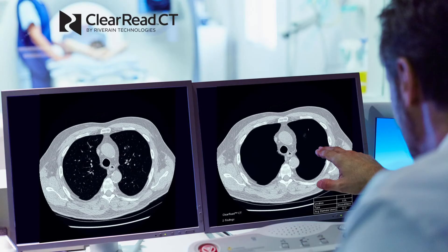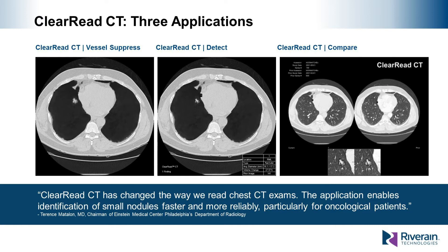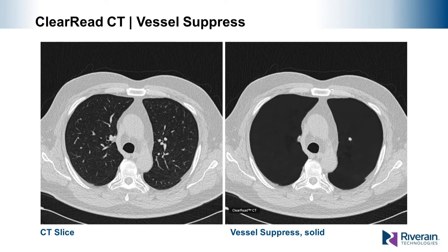ClearRead CT Vessel Suppress is a patented process for the suppression of vascular structure in the context of an axial CT exam utilizing simulated data. ClearRead Suppress works for all nodule types, enabling a clear visualization of nodules by removing structured noise. In this example, we see a typical CT slice on the left and the corresponding slice with vessel suppression applied on the right. This solid nodule finding was read as a false negative by radiologists in the study. Nodules in the central lung are inherently difficult to detect, especially when they are roughly the same shape and caliber as the surrounding vessels. However, with vessel suppression applied, the nodule becomes very apparent as it is separated from the surrounding vascular structure.